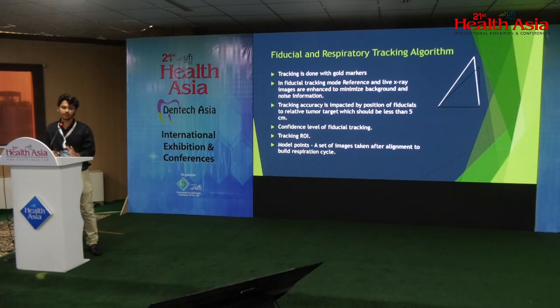We have an X-ray reference image that we take from an initial CT performed before the treatment is started. That image is compared with the live X-ray images, like I've shown before, two oblique right and left angle X-ray images. These images are superimposed on each other. So we have to make sure that the anatomy as well as the markers implanted in the patient are completely aligned with each other.